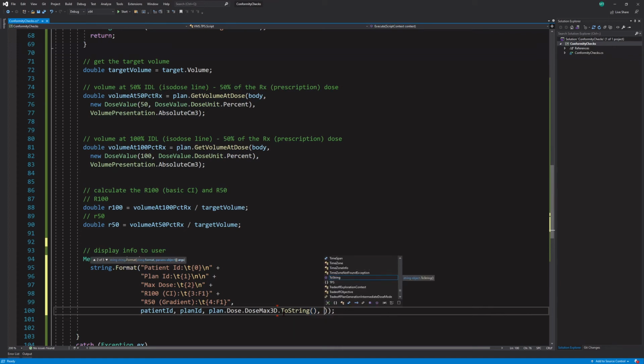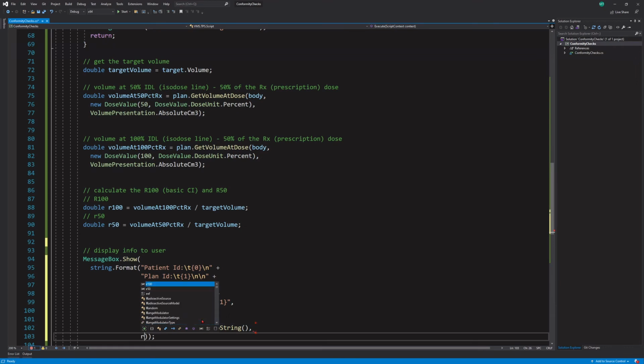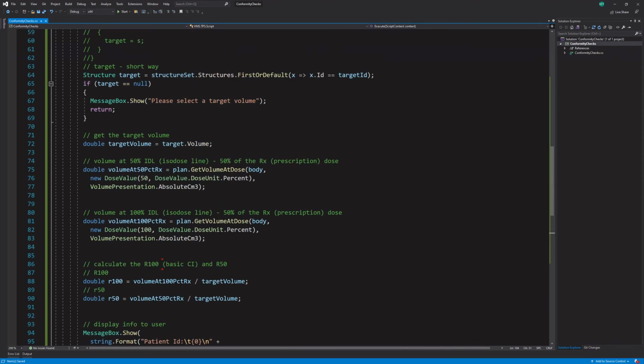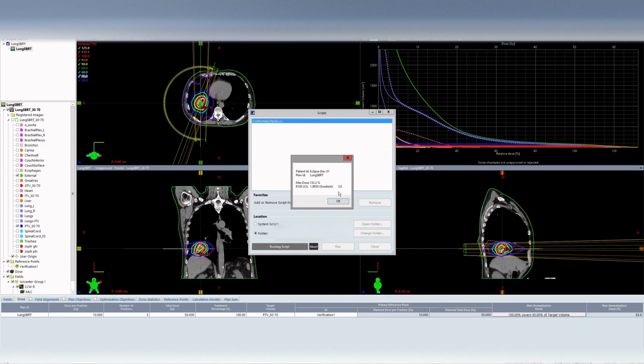Okay, so then let's just go ahead and bring this down. Okay, so max dose, so now we need, what did we call it? The R100, and the R50. Okay, so I believe that should do it. So we've saved it. And let's go and run it. There you go. I hope you can see this. Oh, it looks like it might be really small.